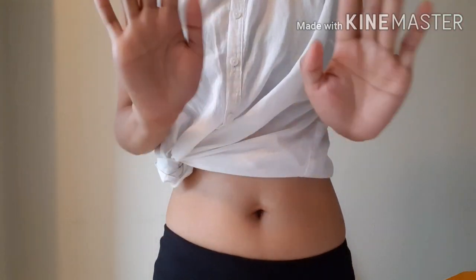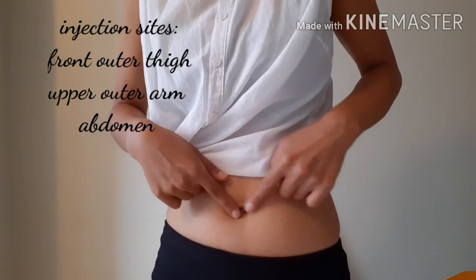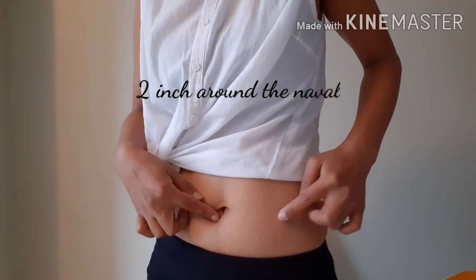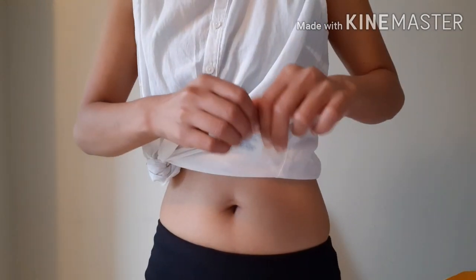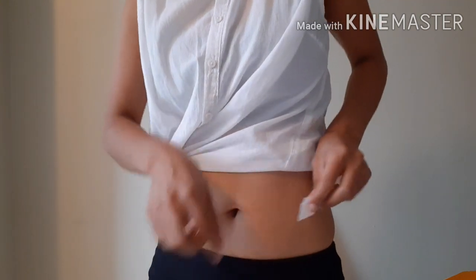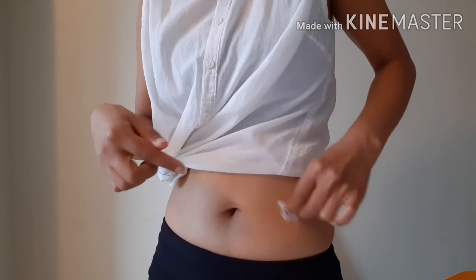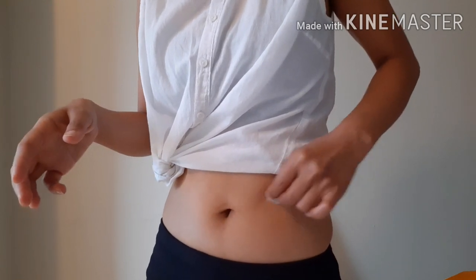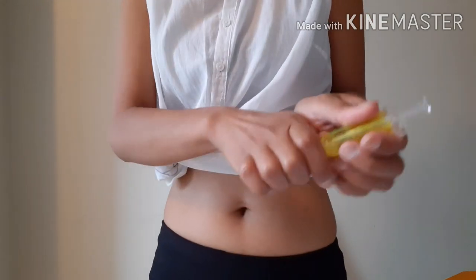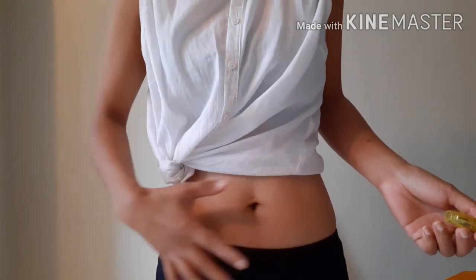My hands are already clean. You measure two inches from the navel — one, two — and that's where we inject. Clean the area with the alcohol swab, then let it dry a little. Also, make sure there's no scar or bruising on your belly at the injection site.